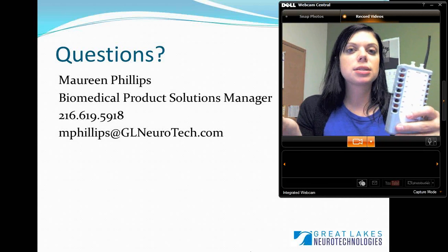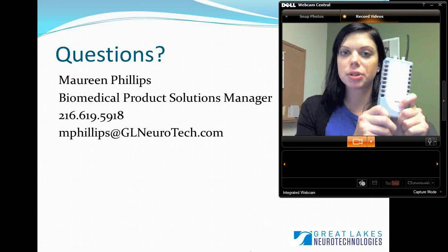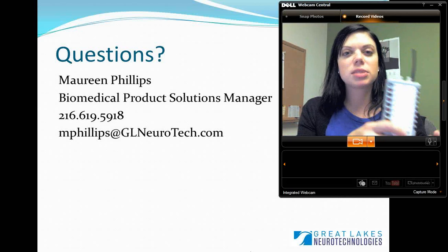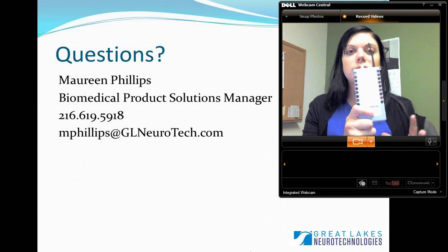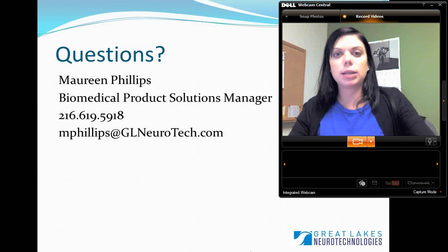If someone is just remaining still in one room, having multiple devices might not be an issue. But if you wanted them to be in a more active environment, having 2 or 3 of these could be a little bit cumbersome. It really just depends, but that capability is definitely there.